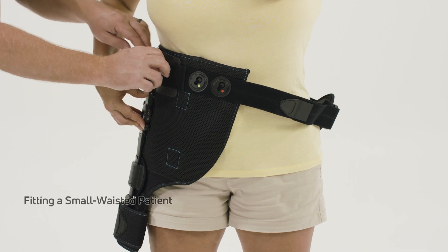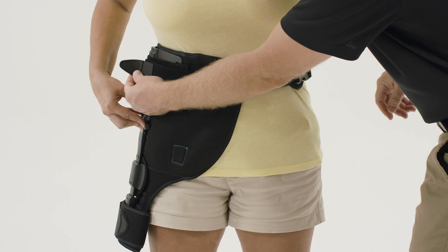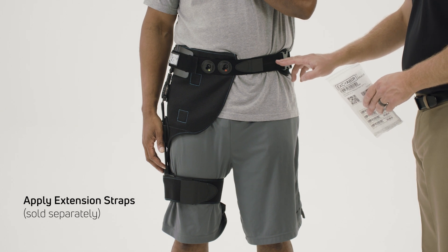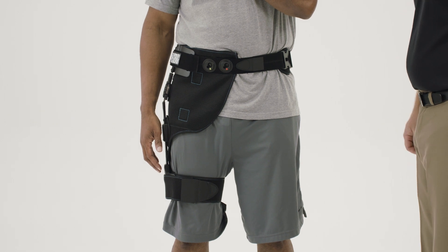For patients with a smaller waist, remove the logo and velcro the waist belt over the hinge. The extension strap can be used to lengthen the waist strap if needed. These are typically used for patients with a waist circumference larger than 55 inches.